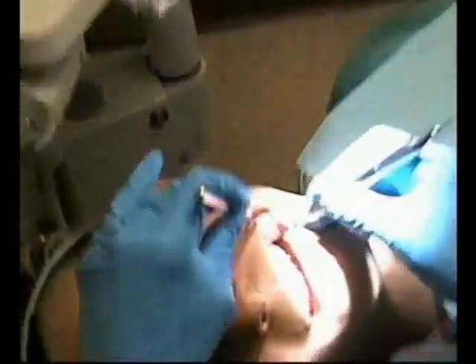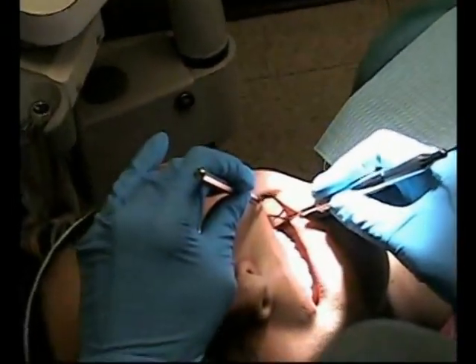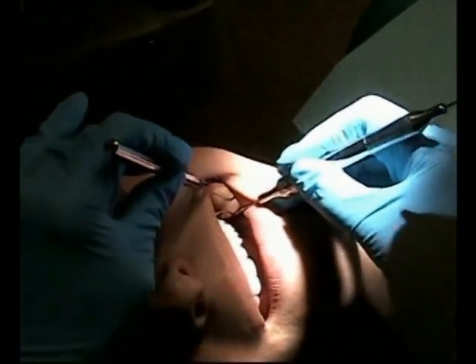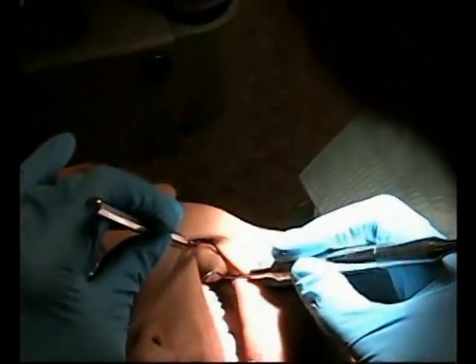Adapt it to the tooth. Walk it back to the trailing edge. Walk back to the leading edge. Watch how the hand is pivoting on the fulcrum as it comes along towards the mesial.